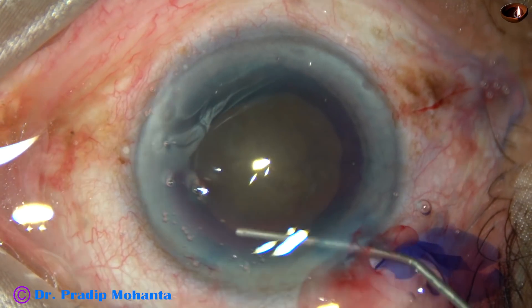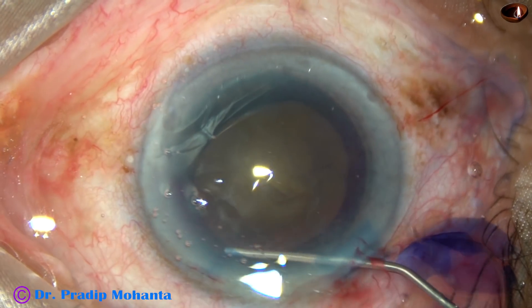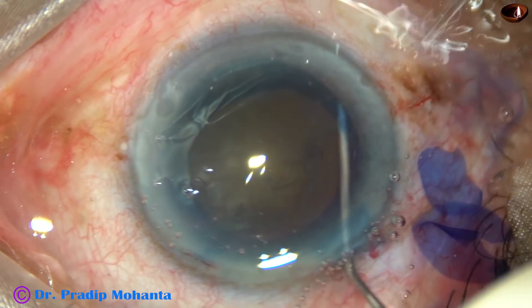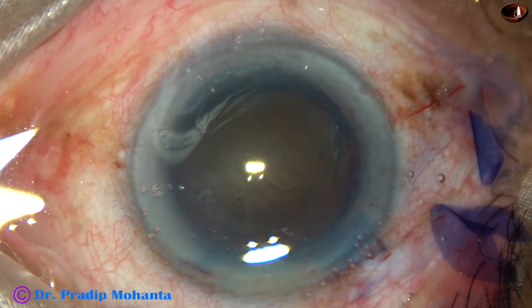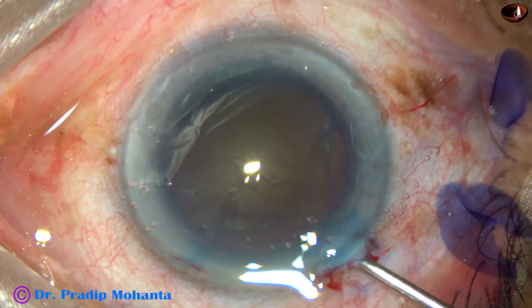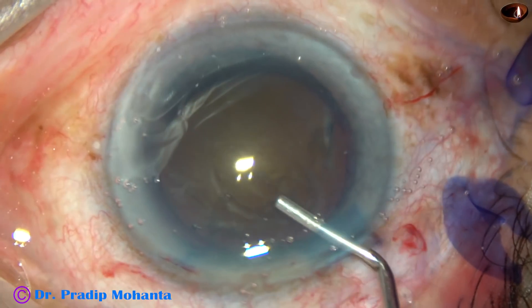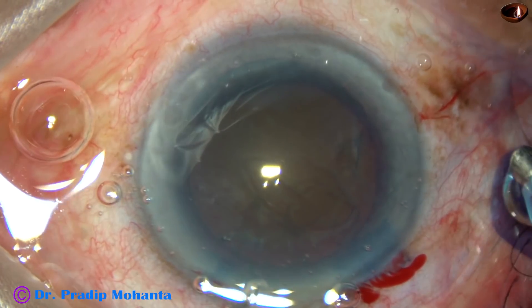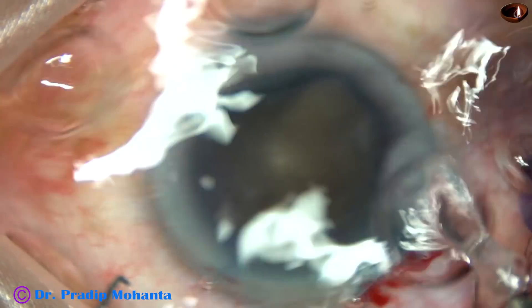Now, hydrodissection. Do hydrodissection at multiple points with a small amount of fluid. Mobilize the nucleus and then inject viscoelastic, then introduce the tip of the FACO handpiece.